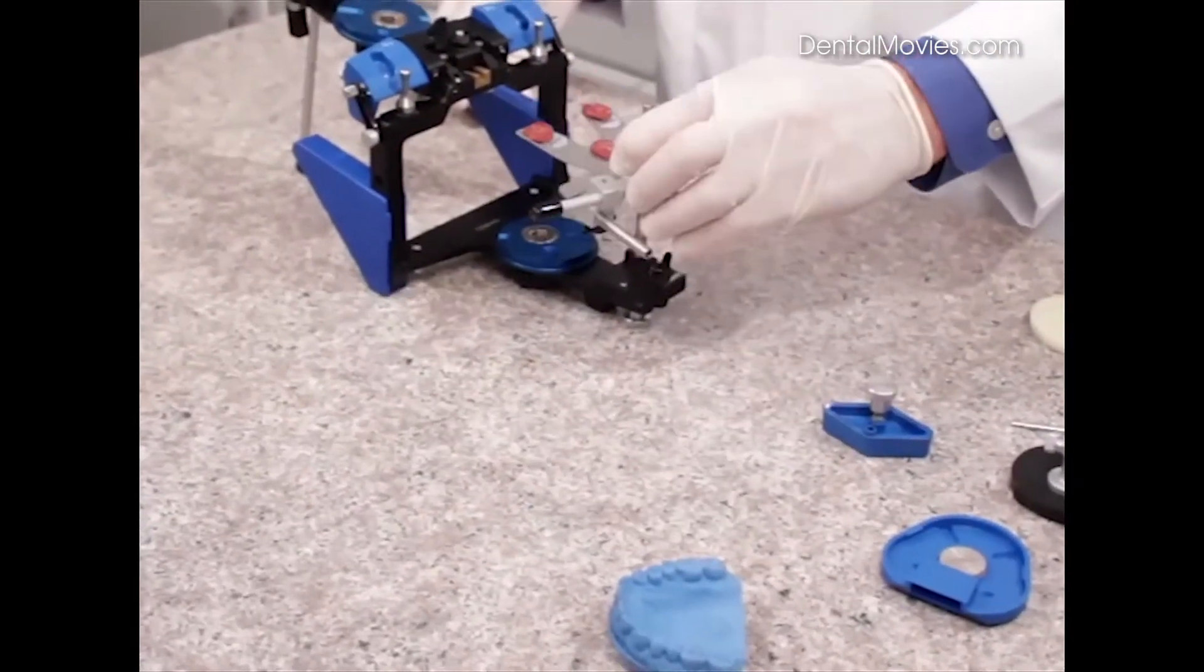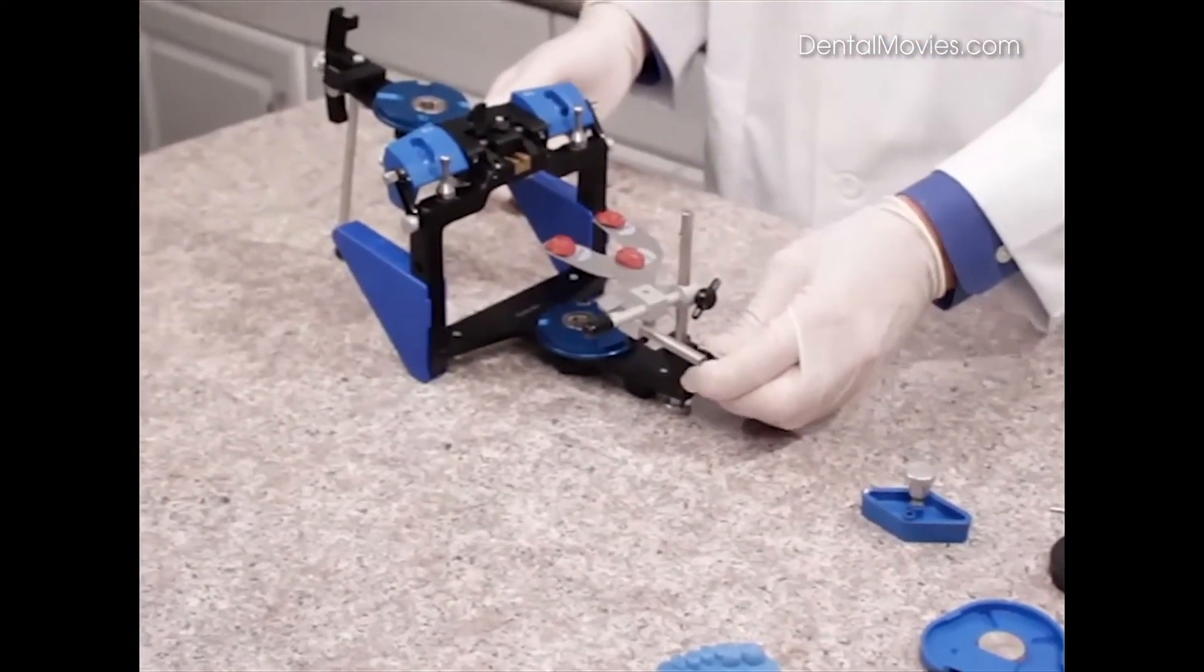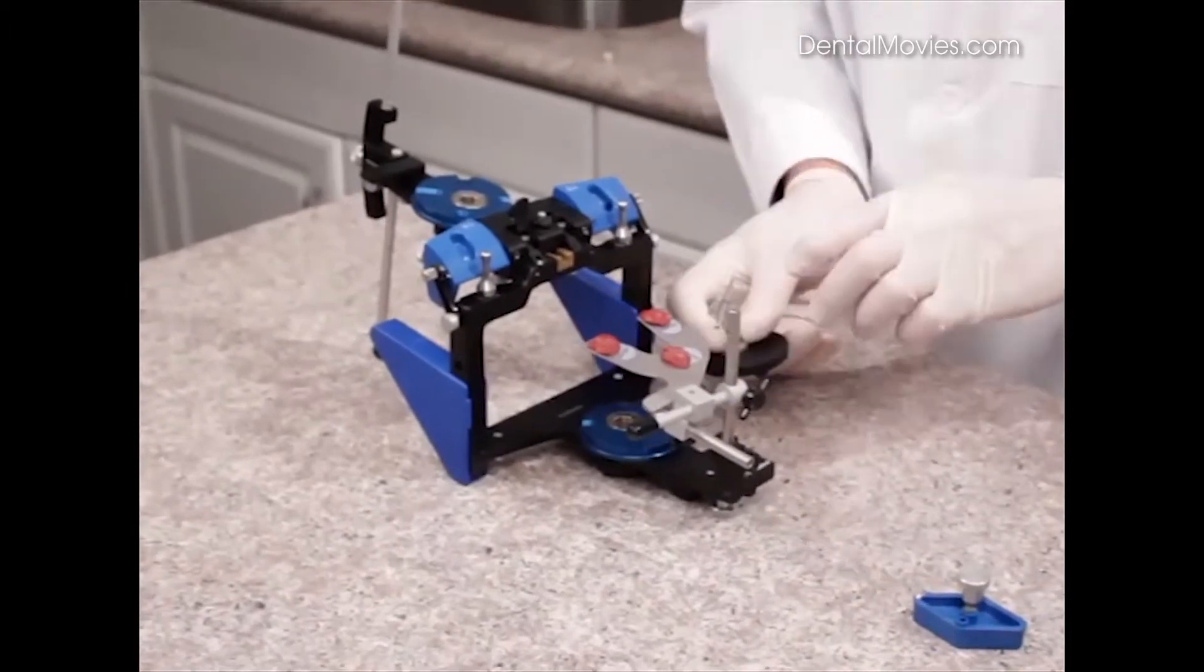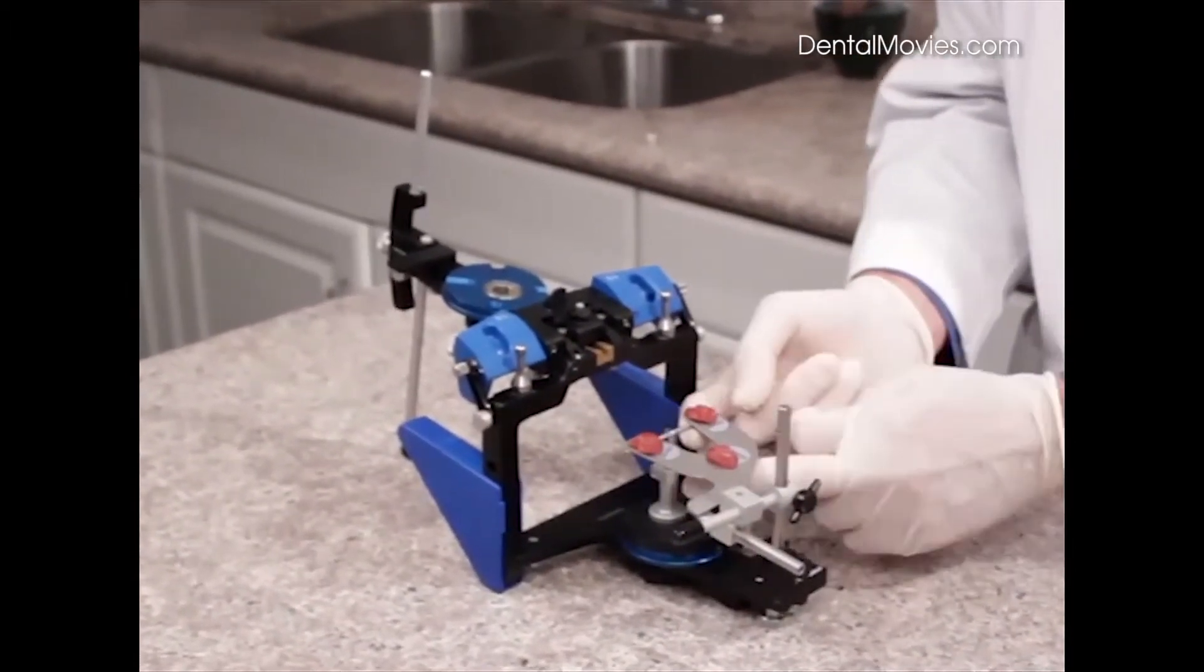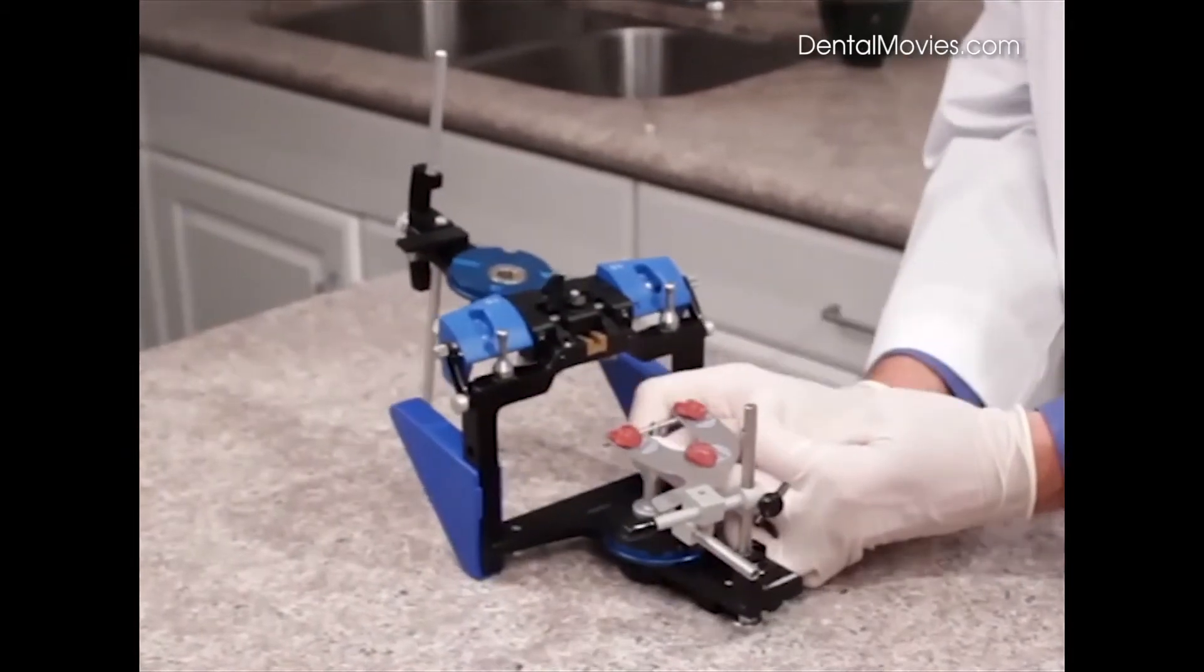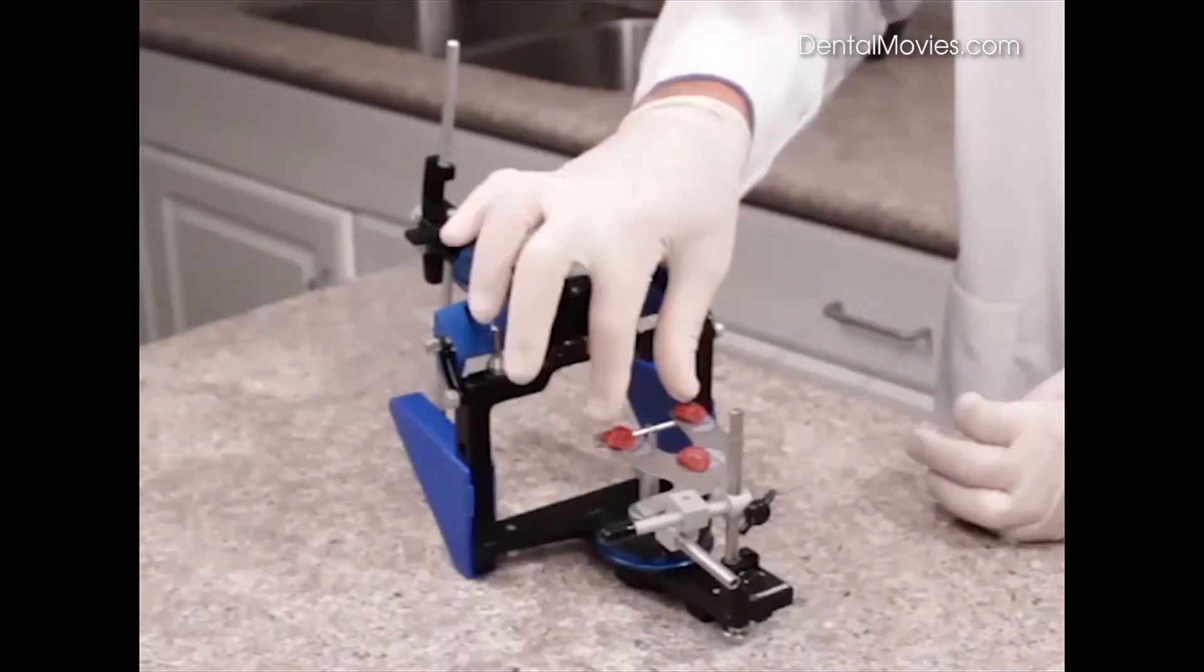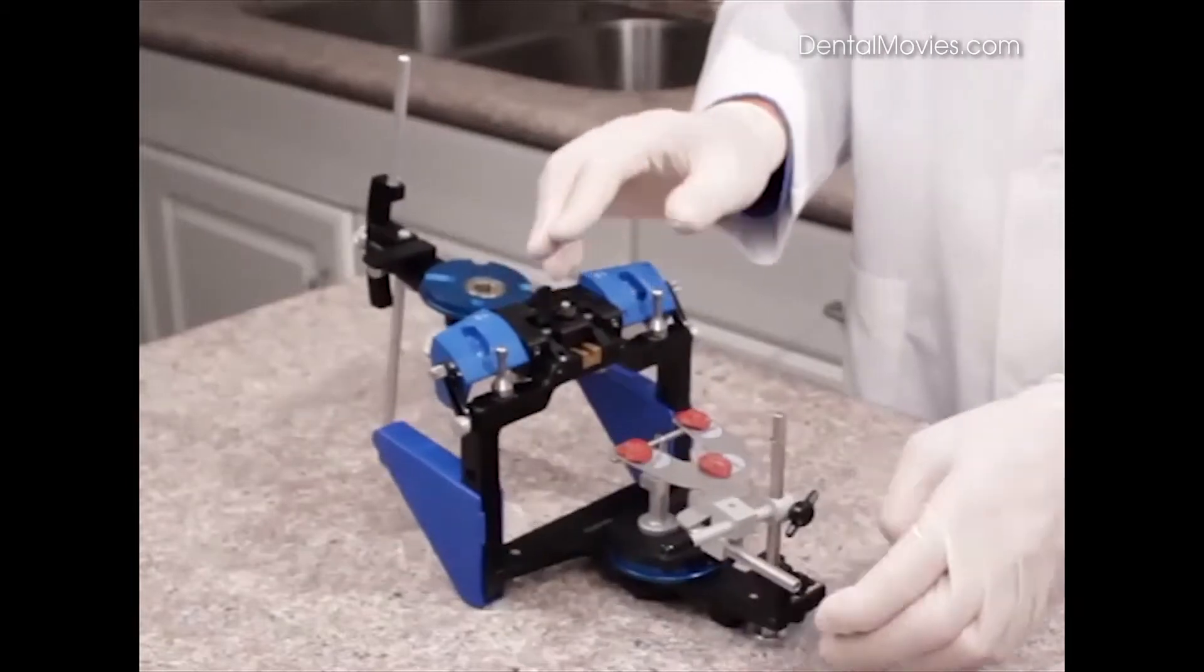We can now add our bifork assembly to the mounting fixture and tighten it into place. We do have a bifork support system, which we can index to the lower magnetic plate, and we can raise the teeter-totter up underneath the bifork and tighten it in place with the screw, creating this nice, solid support for the cast during the mounting procedures.